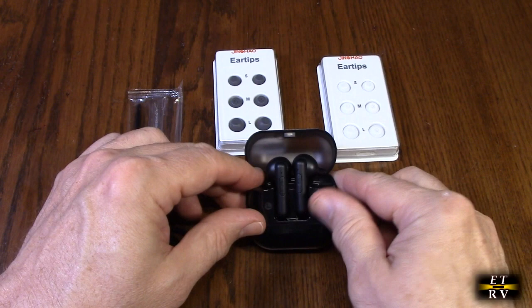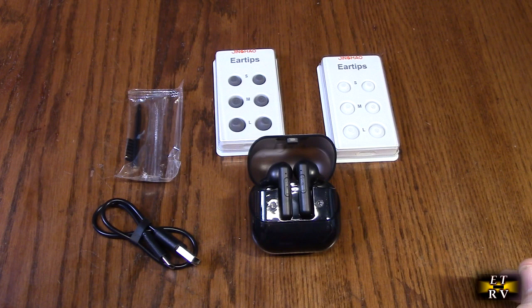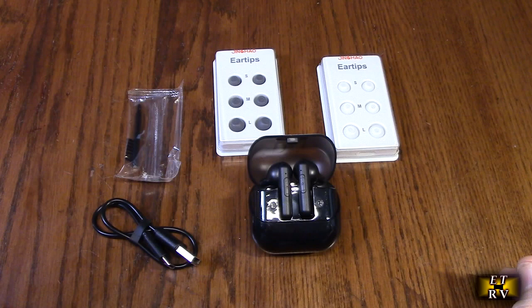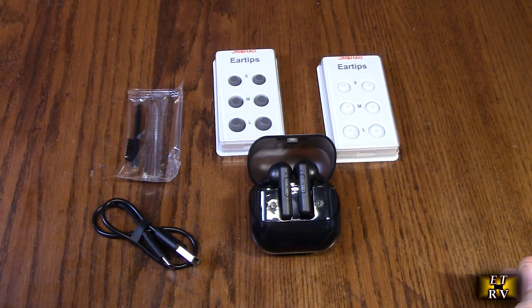The Bluetooth connectivity lets you easily connect these hearing aids to smartphones, tablets, and other devices, streaming audio directly to your ears. This is particularly useful for seniors who enjoy listening to music, watching TV shows or movies. It can switch between Bluetooth streaming and simply amplifying the surrounding sound. The Bluetooth rechargeable hearing aids also include a power display that allows users to easily monitor remaining battery life. The noise cancellation technology helps filter out unwanted background noise, making it easier to hear conversations and other important sounds.